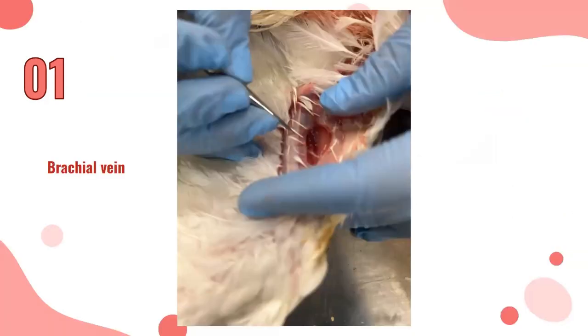The brachial vein is a large blood vessel found under the wing between the biceps brachialis and the triceps humeralis, and is used for blood collection in chickens.